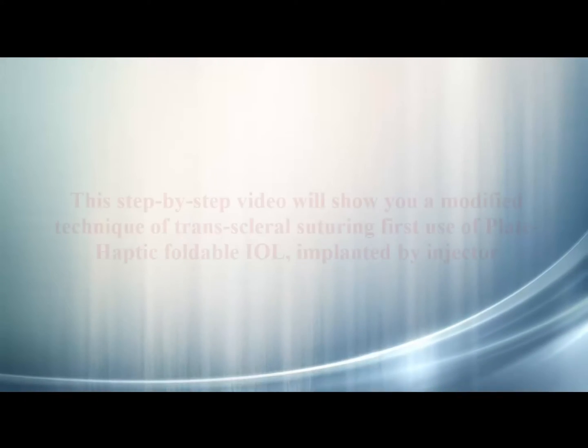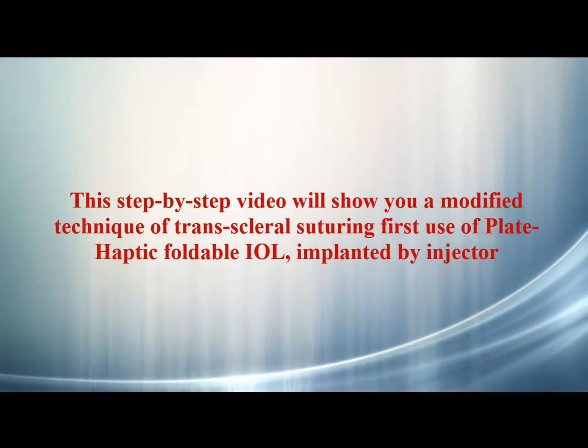In this film, we show a modified technique of transscleral suturing using a single-piece plate haptic foldable acrylic IOL implanted by injector.